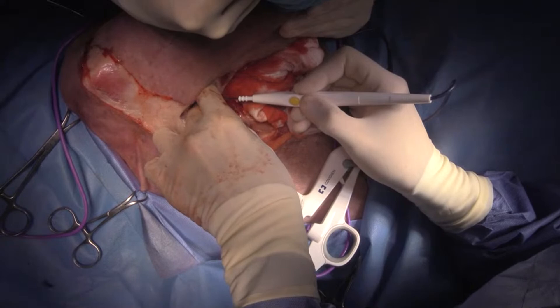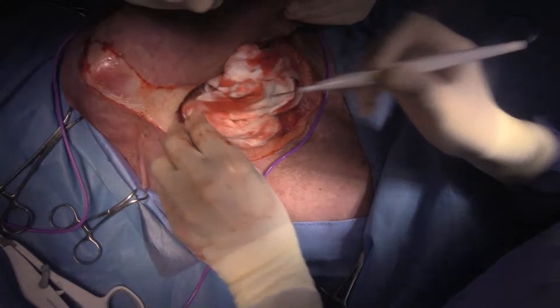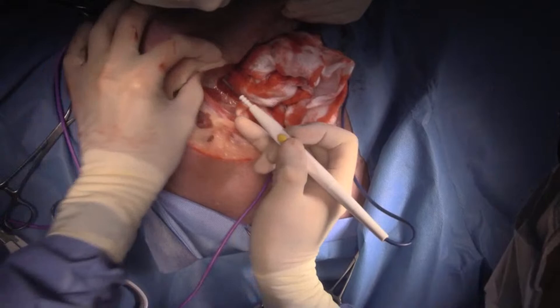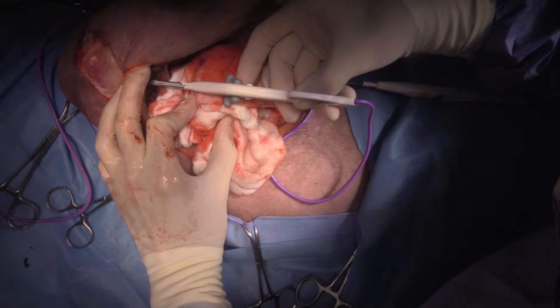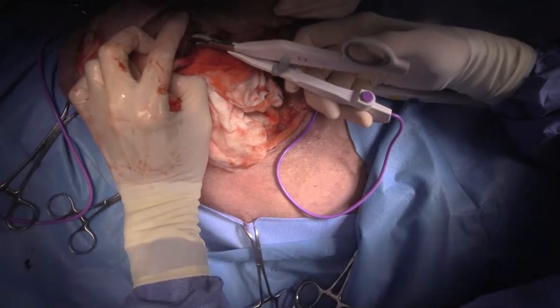Have you already gone through the transverse and descending superficial pectoral muscles? I'm going through the superficial pec right now. Does it have a descending and transverse portion? I think it's just deep and superficial — or it may be superficial, descending, and transverse. I was in vet school more recently than you so I might be right, but Laura can't confirm either.